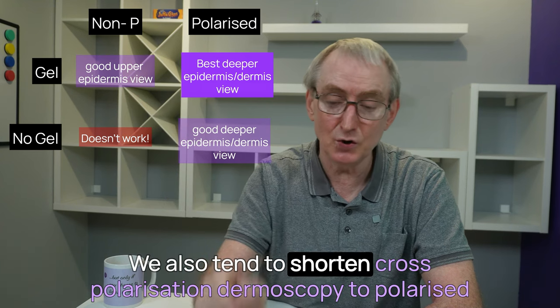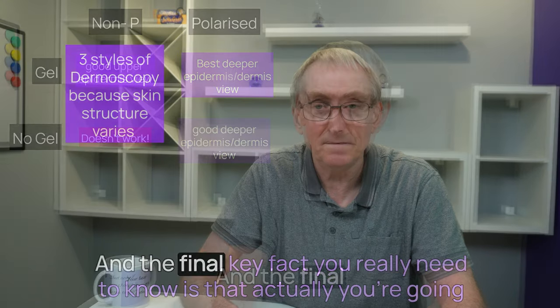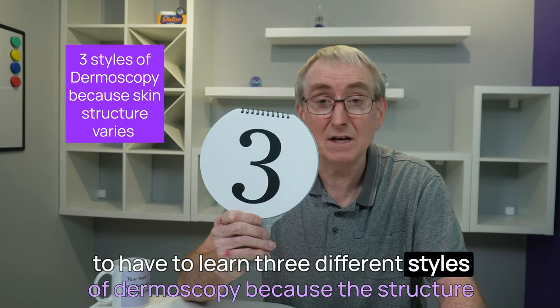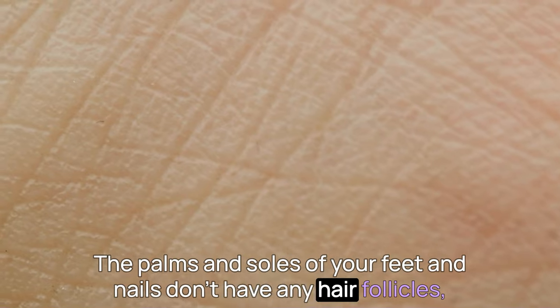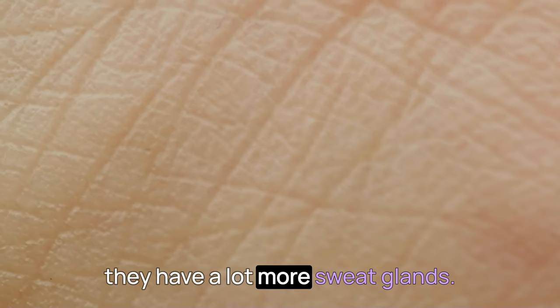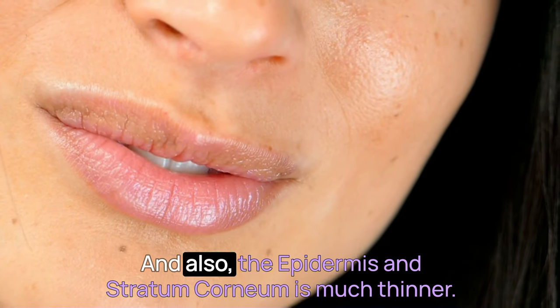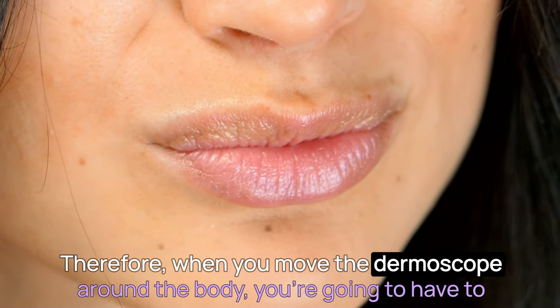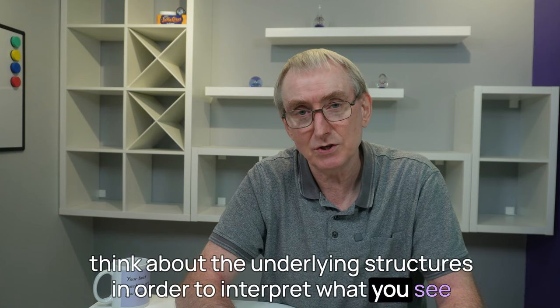The final key fact you really need to know is that you're going to have to learn three different styles of dermoscopy, because the structure of the skin varies around the body. The palms, soles of your feet, and nails don't have any hair follicles but have a lot more sweat glands. The scalp has obviously a lot more hair follicles, and so does the face — and the epidermis and stratum corneum is much thinner there. Therefore, when you move the dermoscope around the body, you're going to have to think about the underlying structures in order to interpret what you see dermoscopically.